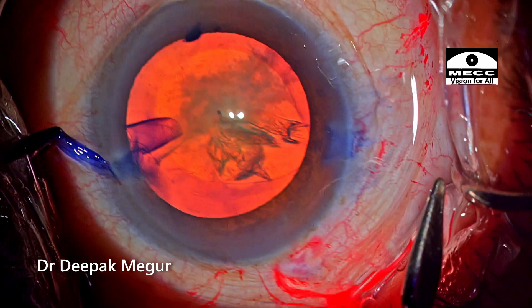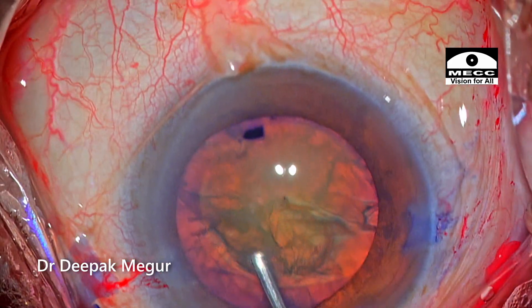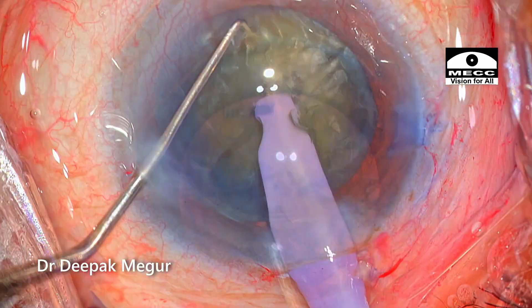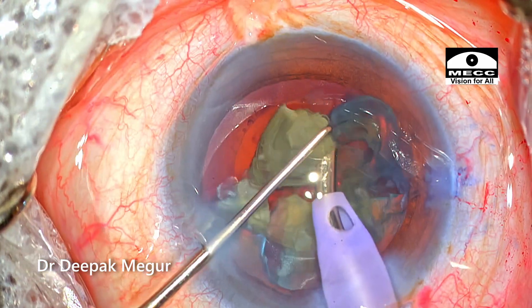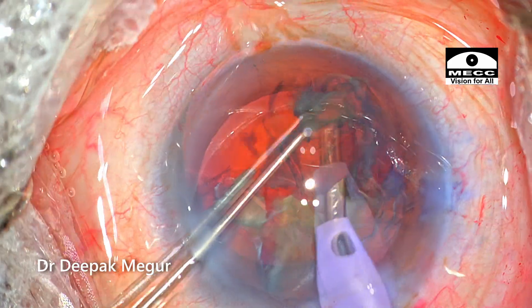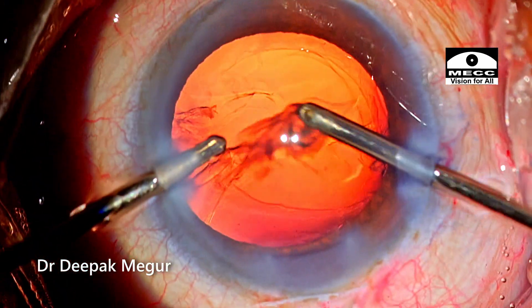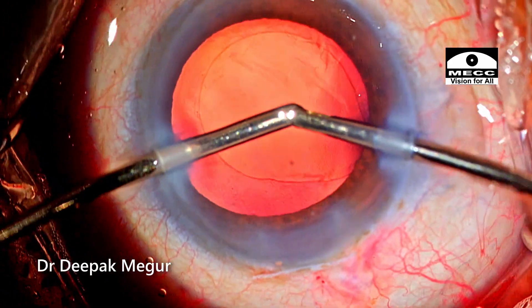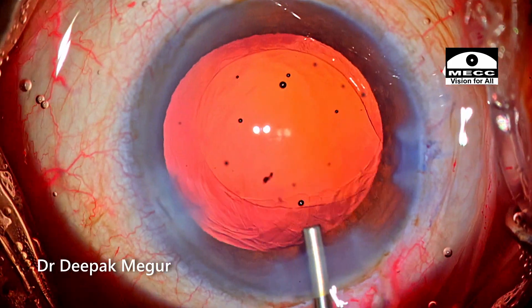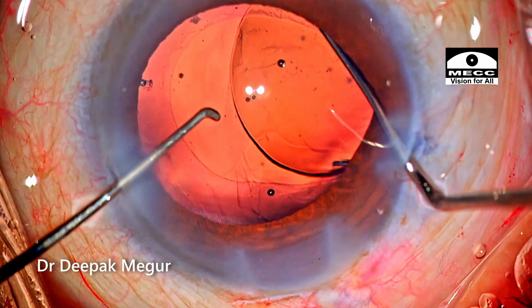So this was a small lesson which I learned and I would want to share with you. In subsequent cases I'm going to try it out in more cases. Moving on, the case was completed in a routine way. Hydrodissection is done and then the nucleus was emulsified. The lens was implanted into the bag and the patient did well.